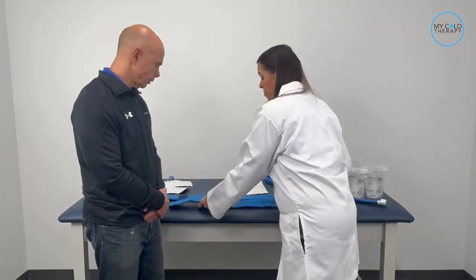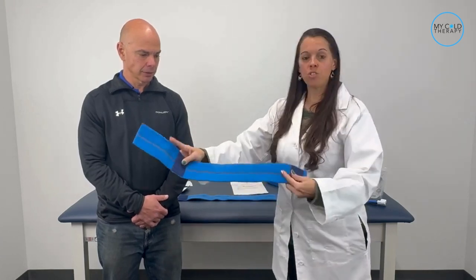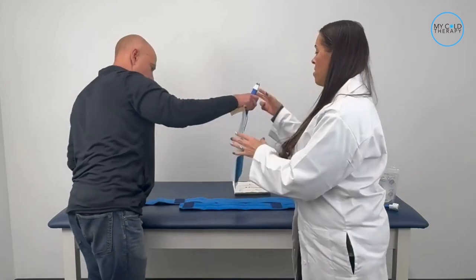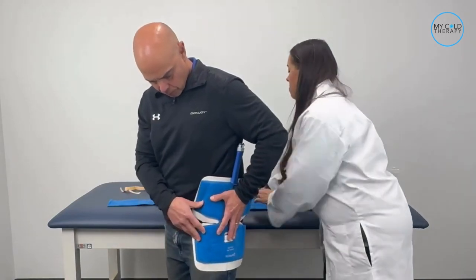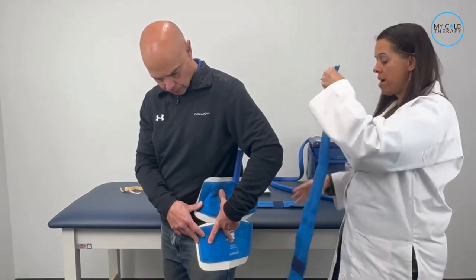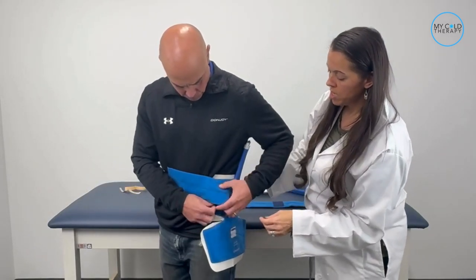The hip pad comes with two straps. These Velcro pieces can be removed and adjusted, which helps you fit the strap better depending on your body type. With the sterile dressing in place and the pad covered, we're ready to put it on the body. We're going to put on the long strap first — the one that goes around your waist — attach it, bring it all the way around, and attach it in the front.